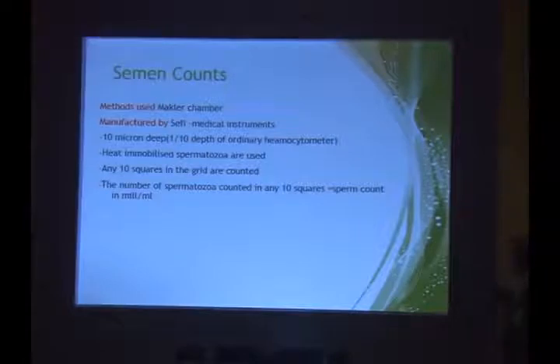So the manufacturer recommends use of heat immobilization, in which case anyway you are introducing an additional step of heat immobilization in a beaker at 50 degrees, by keeping 0.5 ml semen at 50 degrees for 5 minutes before you load the Makler chamber.